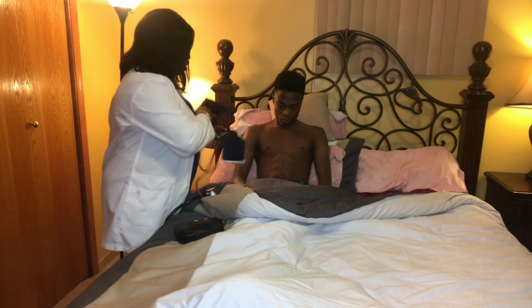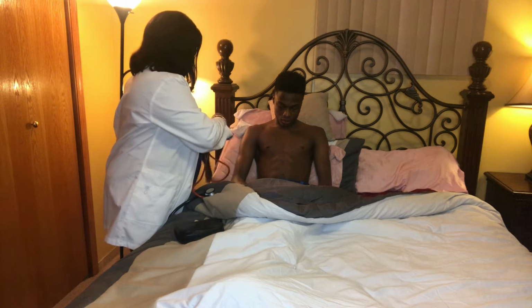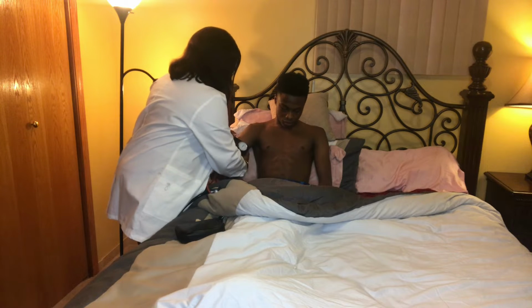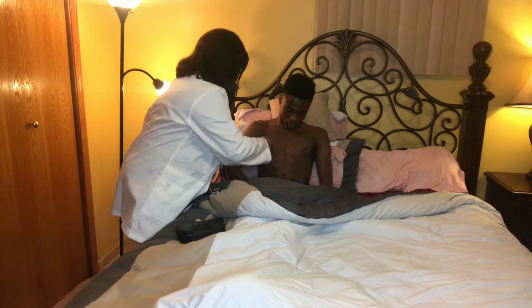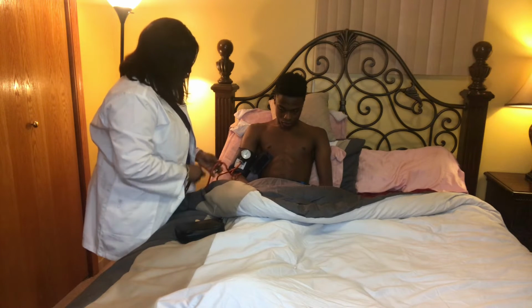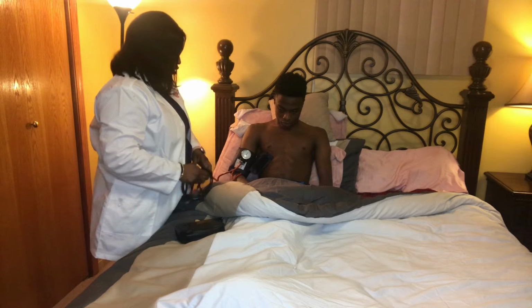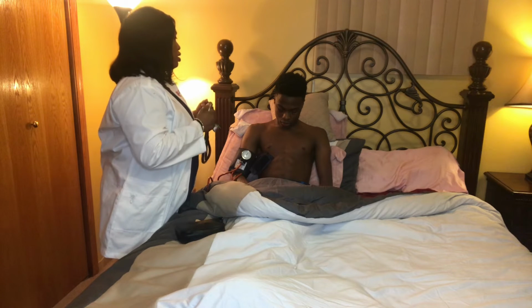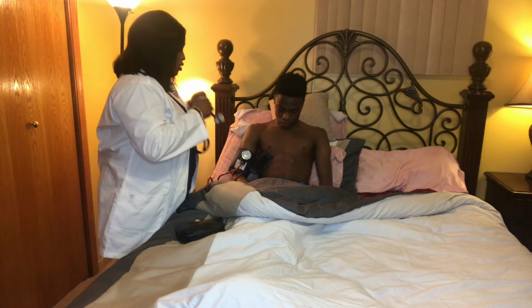I'm also going to come back and check the blood pressure on your right arm while you are sitting up, okay? The reason for doing this is to make sure that there's not much difference, or no drop, between when you are sitting up and when you are lying down in bed.